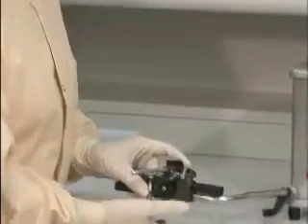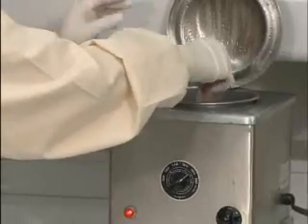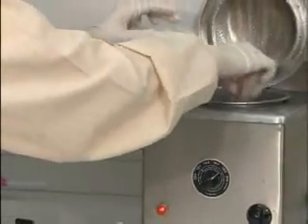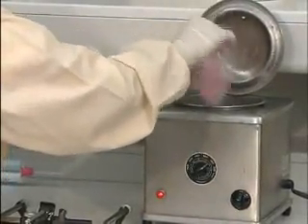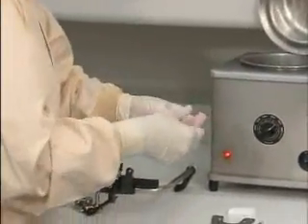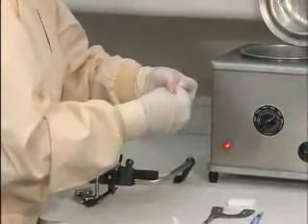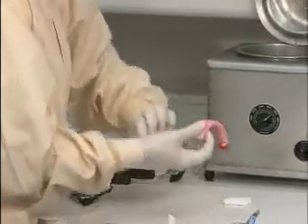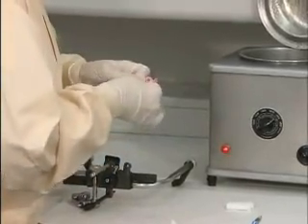Next, you'll need a heat source, base plate wax, and the cavo bite fork to register the upper arch. Prepare the bite fork by folding heated base plate wax. Heat the wax in a water bath or over an alcohol burner, then fold the wax once, fold it again once more, and conform the wax to the upper and lower side of the bite fork.